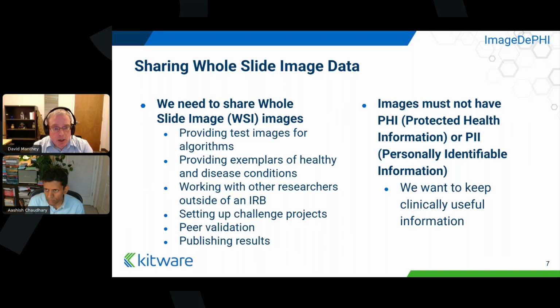Obviously, if you're working with another company or with collaborators, you need to share that data, and by having it anonymized, you reduce the challenges of going through an IRB and all the work that goes with that, and making sure the data is kept secure. And of course, if you publish results, you often have to publish a data set with your results so that you can actually let other people validate them and do due diligence on that.